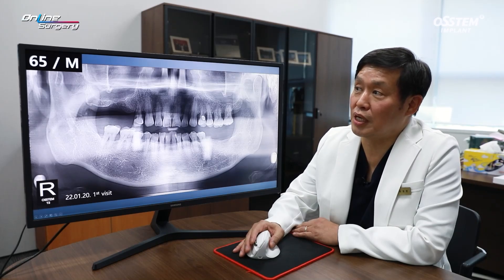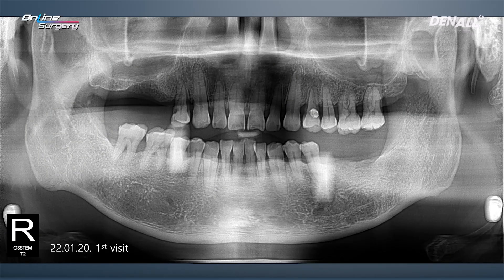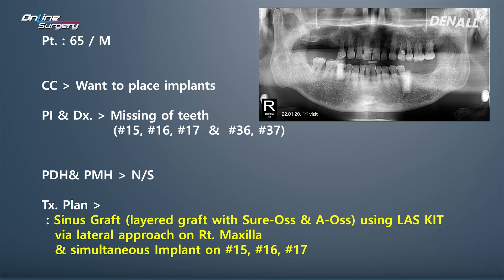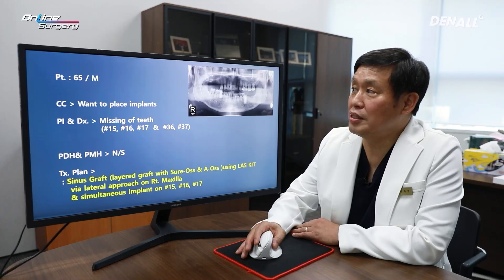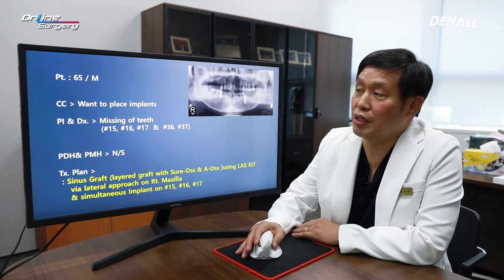Let's take an overview of the case. This is the panoramic image at the initial visit. This is a 65-year-old male patient with missing teeth in the upper right quadrant and lower left quadrant. The chief complaint was missing teeth on both sides. Numbers 15, 16, 17, 36, and 37 are missing.